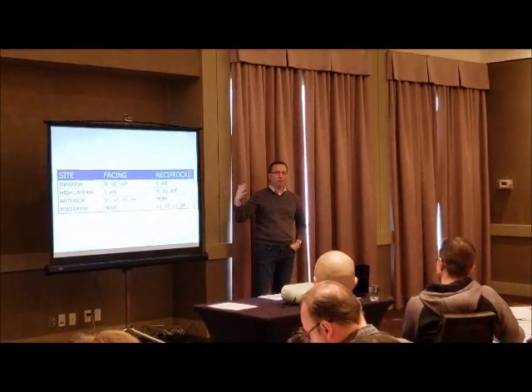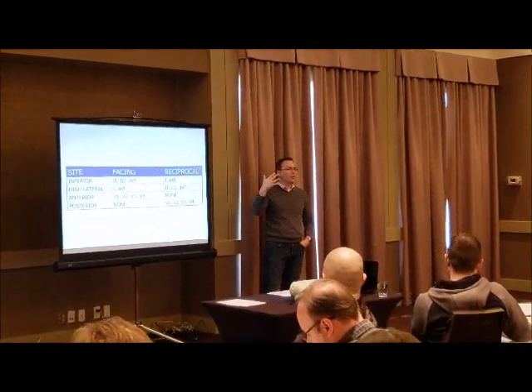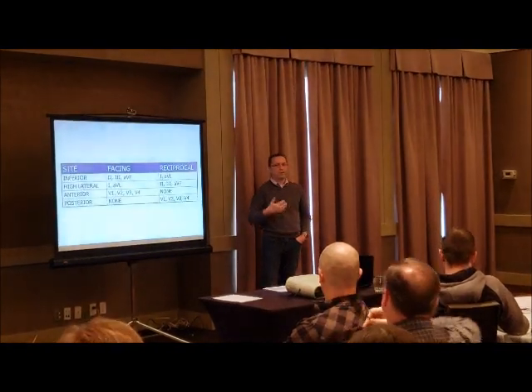So there are your charts, for whatever good they do you right now. What we're going to do is look at a bunch of these infarcts, and that's what's going to drive the message home.